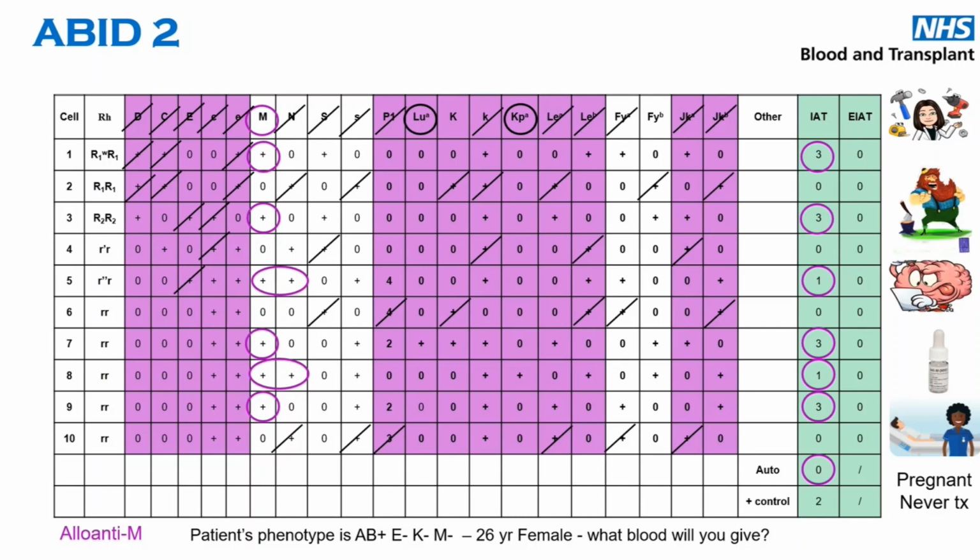So we'll move on to our next antigens and start with exclusions. I've gone with the Wb there and excluded that, but you can only do it on one. Personally, if this was my antibody ID, I'd be inclined to see what I've found and then put another cell up just to get a second exclusion, but you don't have to, that's just my weird antibody obsession. Excluded my Wa, great.